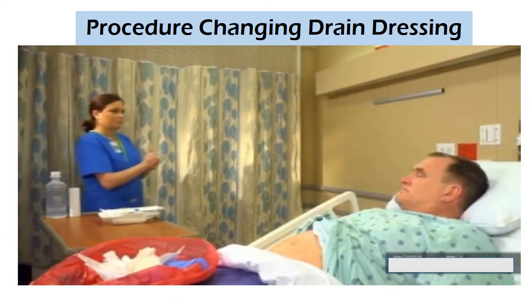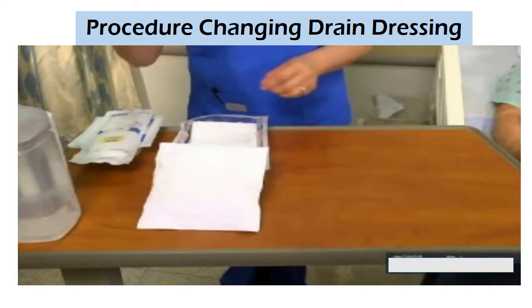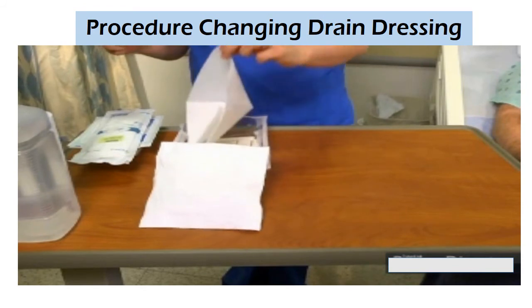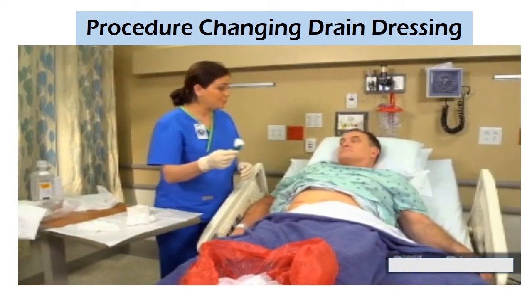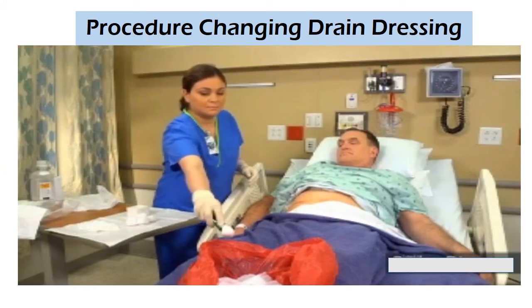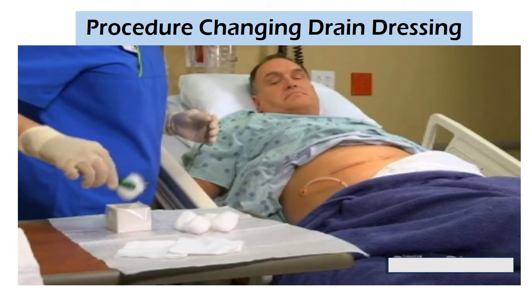Now create a sterile field by placing a sterile dressing tray or individually wrapped sterile supplies on the overbed table. If a sterile solution has been prescribed, pour it onto the sterile gauze. Depending on your agency's policy, you may put on sterile gloves to provide wound care, or you may use a no-touch technique, which calls for wearing clean gloves to hold sterile forceps.